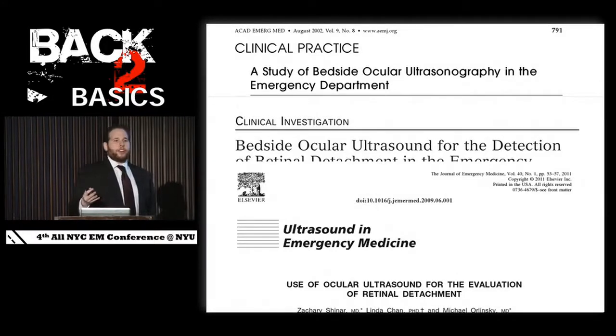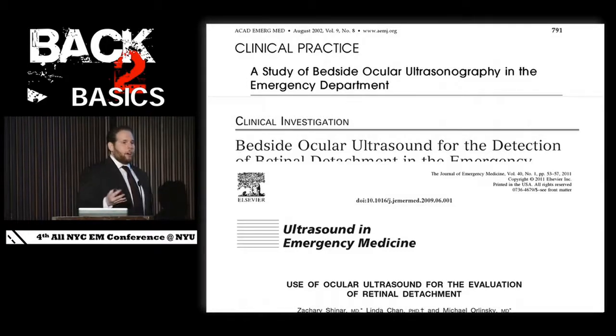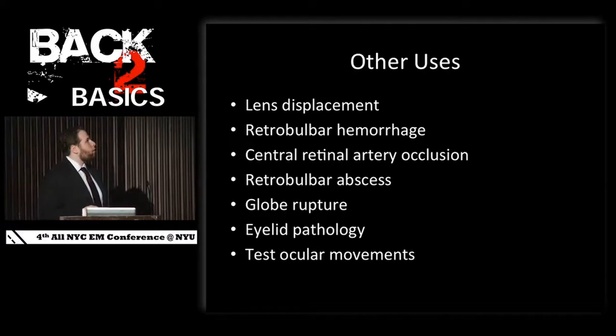So I think if you think about it, it might help you. Maybe it's 3 o'clock in the morning and you're like, should I call the ophthalmologist? Should I not call the ophthalmologist? You can throw the probe on. It's not going to hurt.